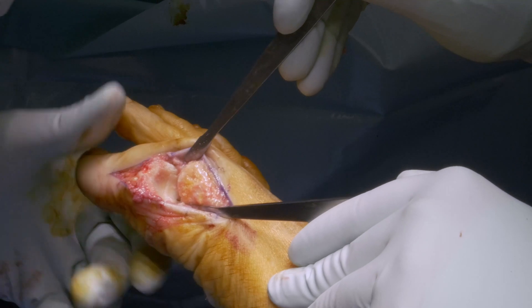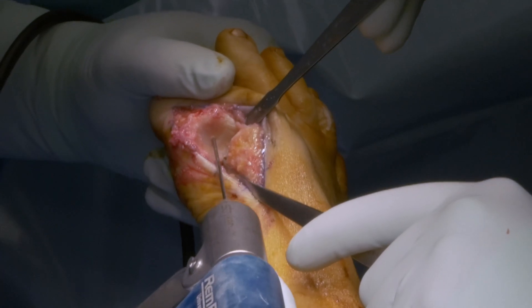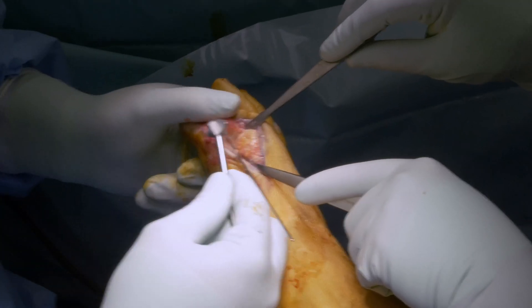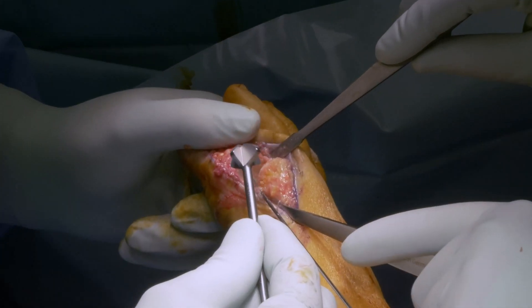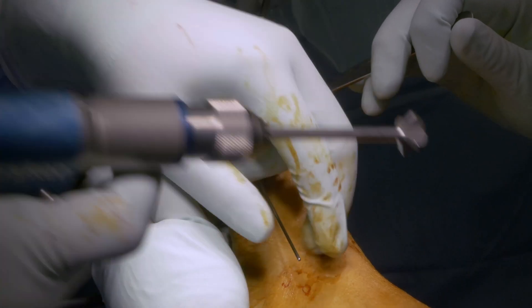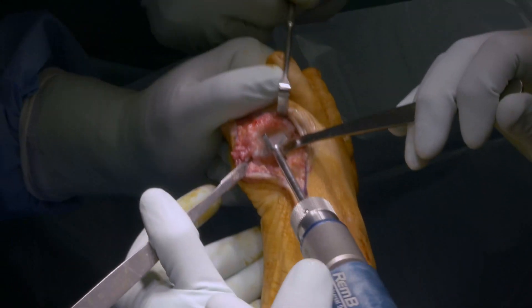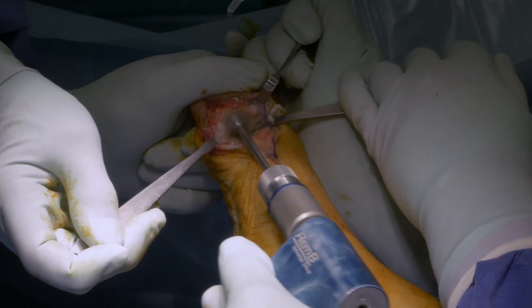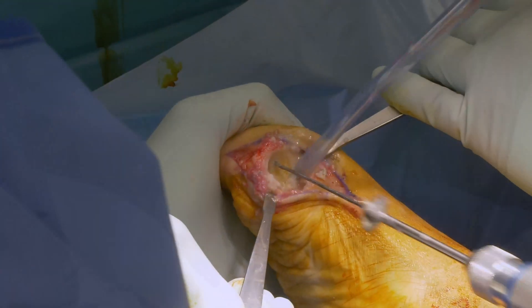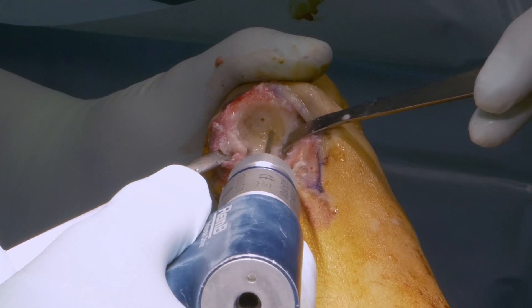The phalanx side is prepared for reaming. A 1.6 mm K-wire is inserted into the centre of the articular surface along the axis of the proximal phalanx. The cup reamer is slid over the K-wire to remove all cartilage on the proximal side. Cool during reaming with water to avoid overheating. Again, micro-drilling is performed for better and faster fusion of the joint.